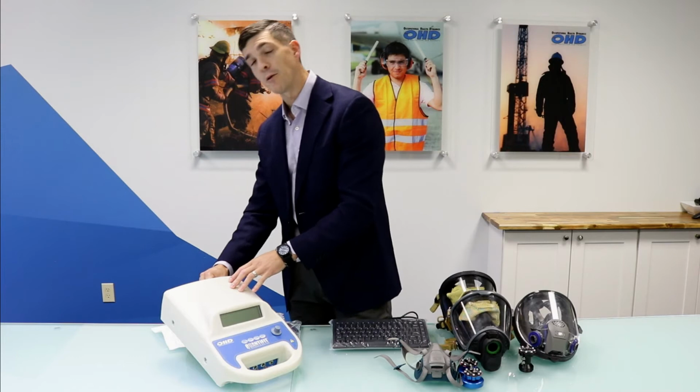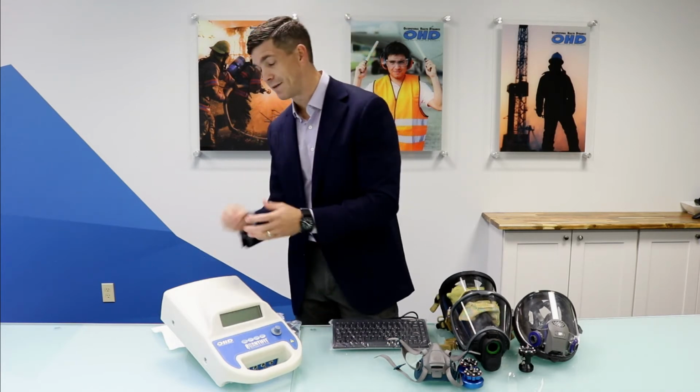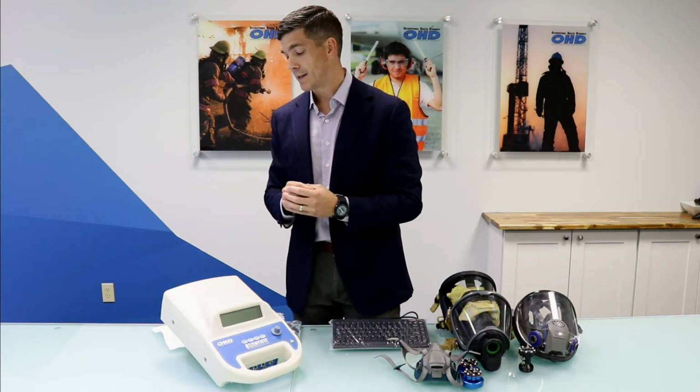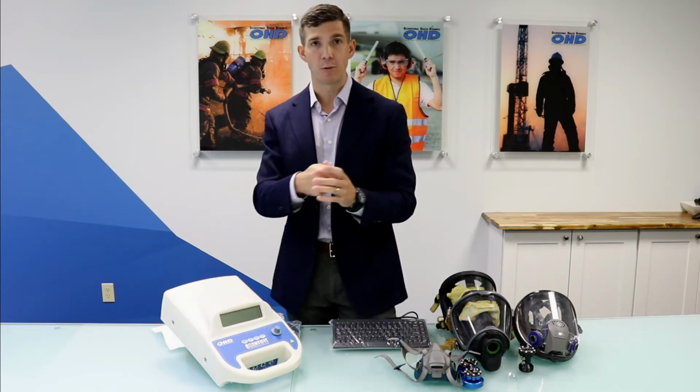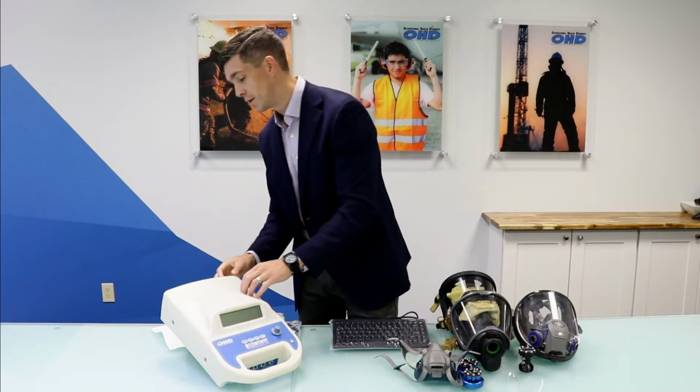Let me say one thing before I move forward. The power supply has an auto lock on the cable. You cannot pull that out like a vacuum cleaner from the wall or pull it, yank it. You really have to disengage that. That's something that we see issues with if people just yank it out of the back of the machine. We need to disengage that and pull the supply.